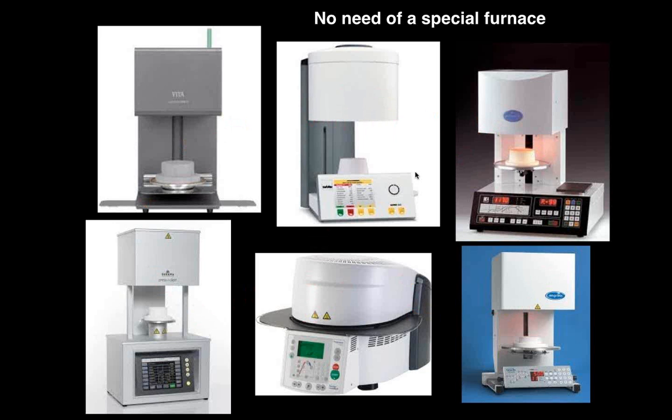That's one of the nice things that they really said, okay, let's not make this material complicated. Let's try to make a material which basically goes straight forward. You just grind it, you place it on a platinum pin, you put it in the furnace, you start your program, you don't need anything special, and you go to this crystallization process. And the crystallization process, it's about an 8 minutes hold. I think about the whole rise, I think it's about around 12 minutes, so it's about a 20 minutes process.